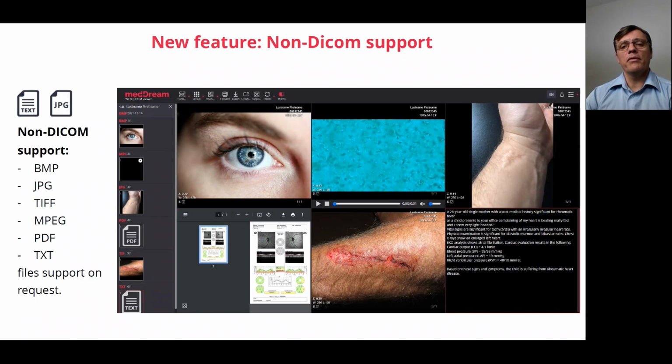But even if you are not a PACS system or a VNA, but for example a RIS system or an informational system, you can utilize these new interfaces. Of course, for that reason, you need to work more deeply with our integration department, with our architects and our programmer team to design the correct plugin and the correct communications. But if it's done, you can achieve very unique workflows for your users.